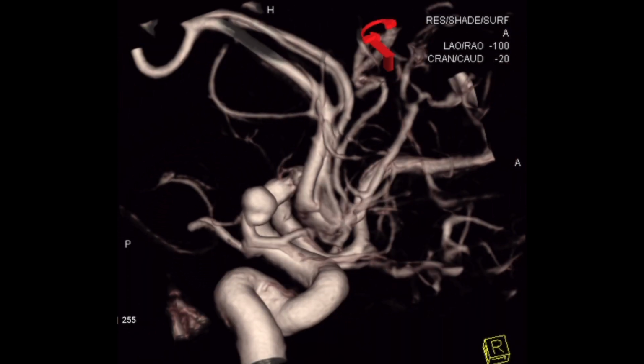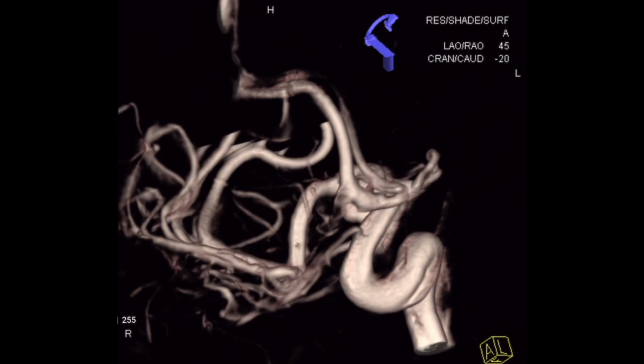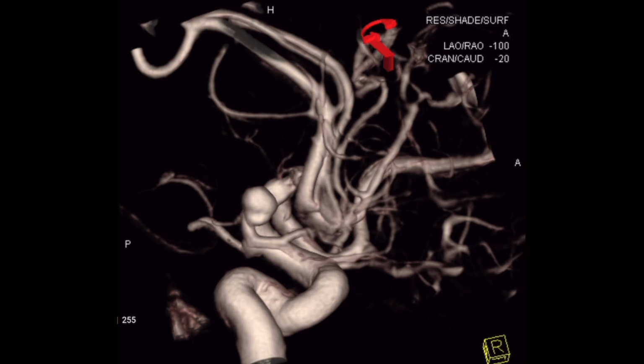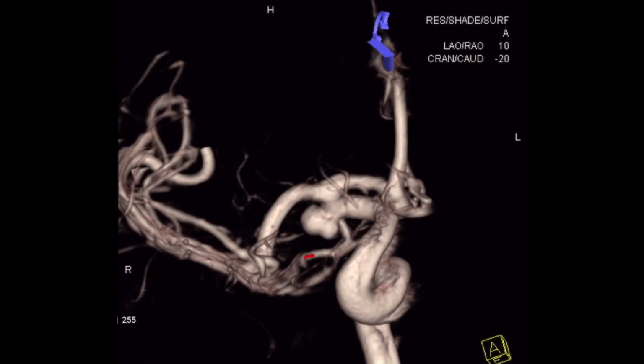And this is the 3D angiogram of the aneurysm. As you can see, it's at the origin of the PCOM. It's lobulated, saccular, with a relatively wide neck. The plan was to implant the microstent from the PCOM to the ICA retrogradely and to go with the microcatheter through the stent struts in the aneurysm sac and to coil the aneurysm sac after that.